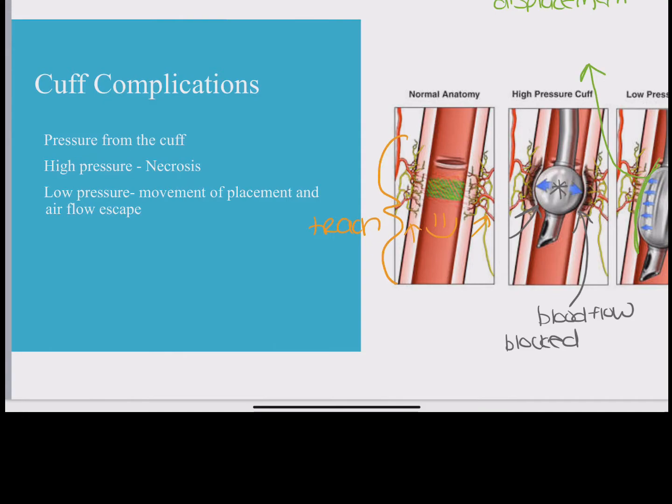Oh man, airflow can now escape through here, and now it's not going to the proper area, which is to your lungs.